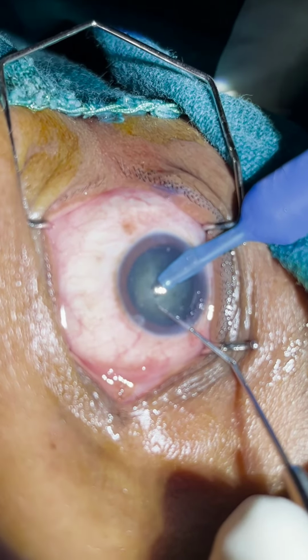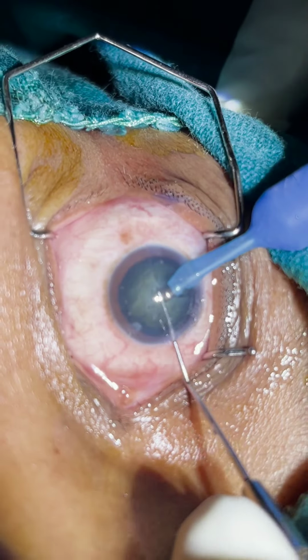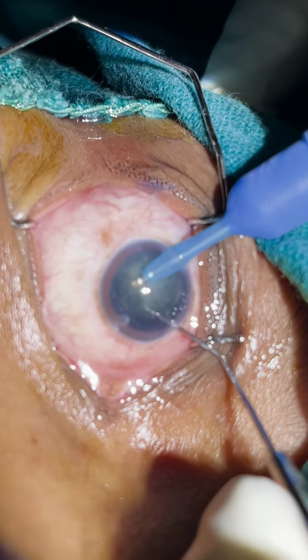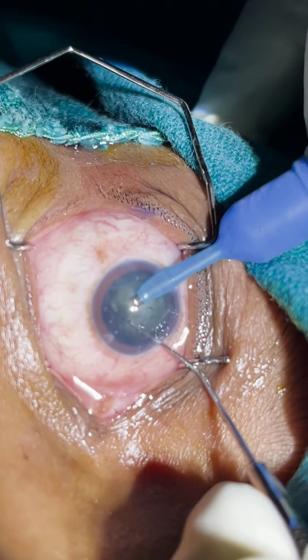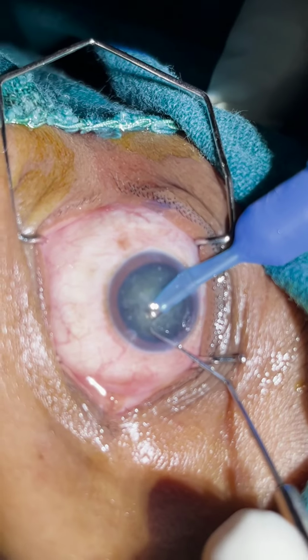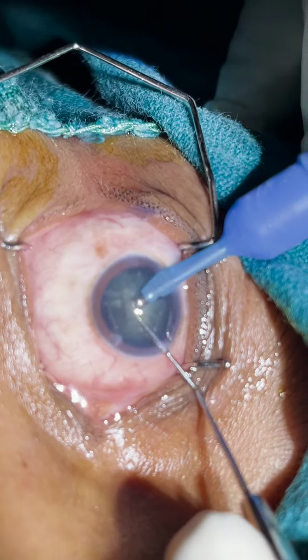After making the nucleus into two heminuclei, I am dividing each heminucleus into four smaller fragments. After making them into smaller fragments, we'll bring the pieces to the center of the pupil and emulsify. Never ever emulsify at the periphery. Never ever. So now I'm catching hold of the piece, bringing it to the center and emulsifying.